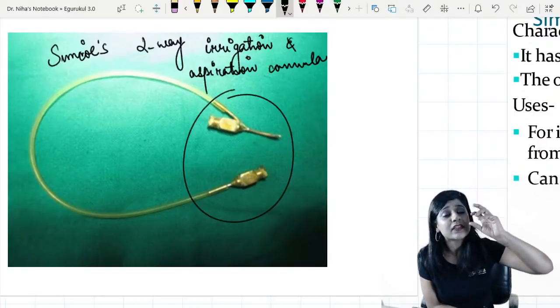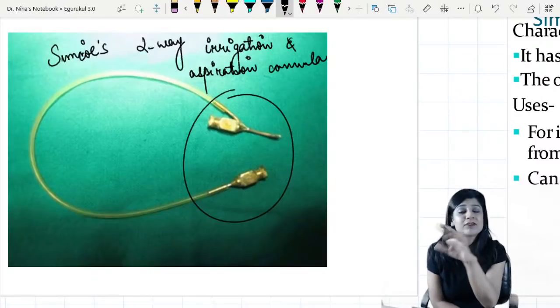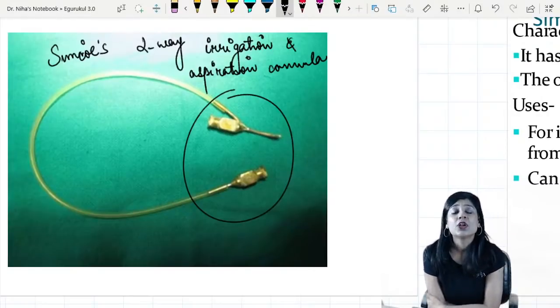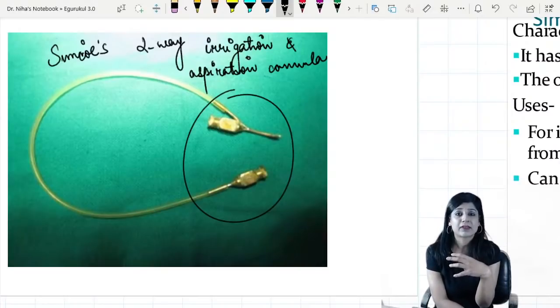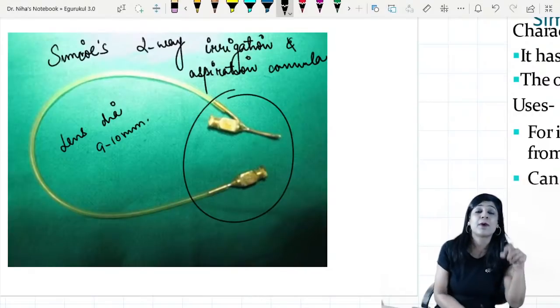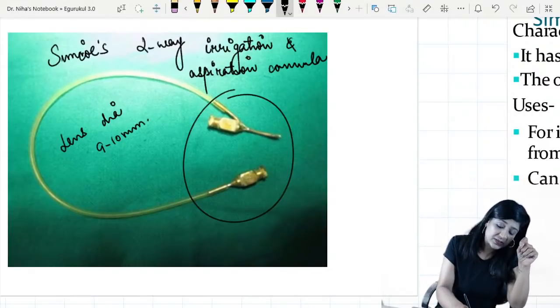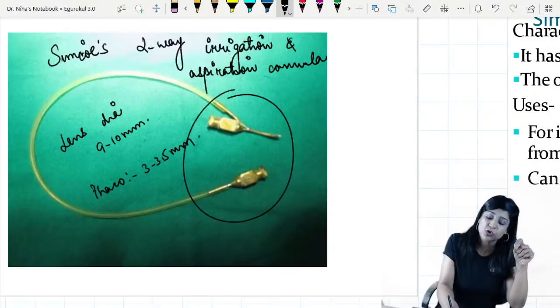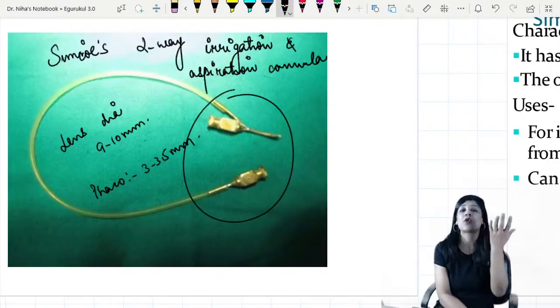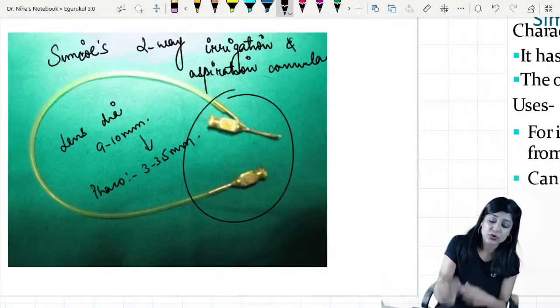If you see, we have given the incision also. We have done the anterior capsulotomy. We have made a tunnel. We have made an entry, hydrodissection, hydrodelineation. We have done. So then we have to aspirate that cortical matter, because the lens diameter is actually 9 to 10 mm. But the incision we are giving is very, very small in cases of phaco. How much are you giving? It is just 3 to 3.5 mm.